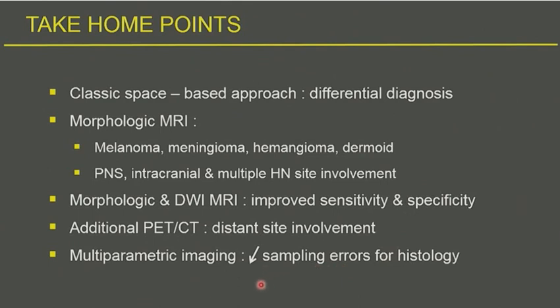And last but not least, help your surgeons to plan the biopsy, because using multiparametric imaging by choosing those areas where you have the lowest ADC and the highest SUV from PET-CT, you will avoid sampling errors for histology.